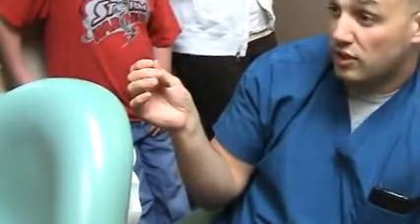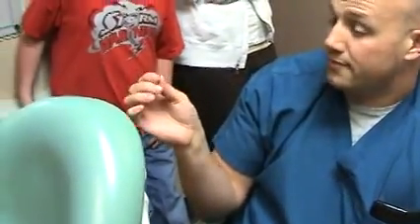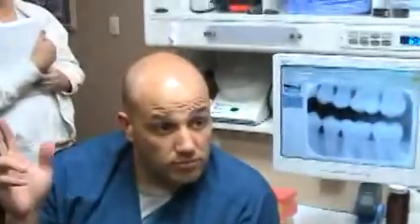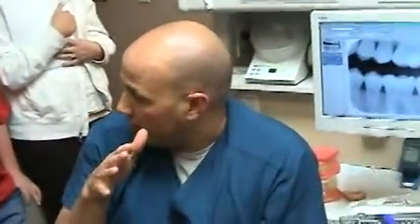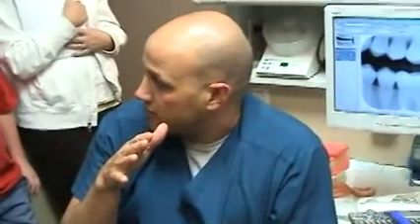Okay, and I'm going to use a slow speed drill. Exactly. How many in here have had a cavity? Did you feel something in your mouth that vibrated a lot when they were drilling it out? Yeah. Okay. That's what this does.